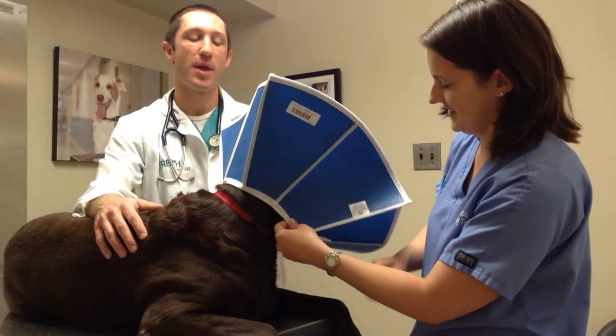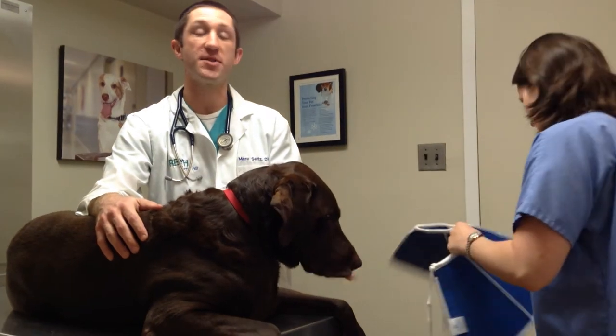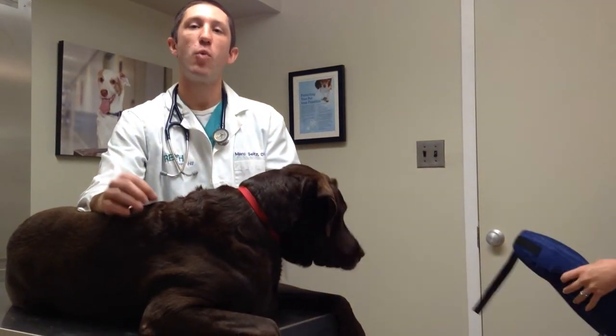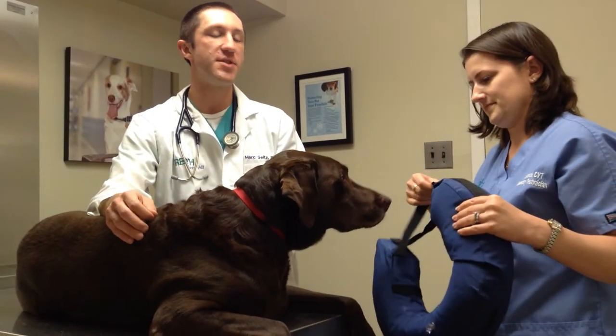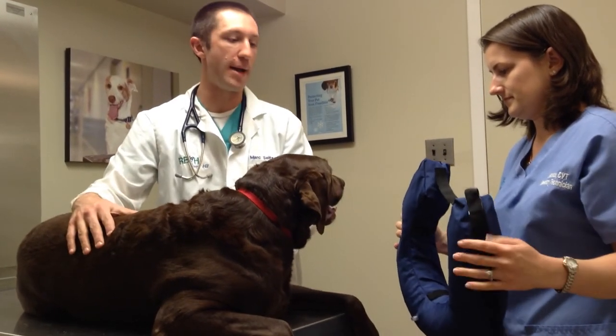Those first two types are probably the best at protecting structures on the head — the eyes and the ears. These next two work by preventing neck mobility, but their disadvantage is animals can still scratch at their neck and face. So these are probably only a good idea if you're trying to prevent licking or chewing somewhere on their body.